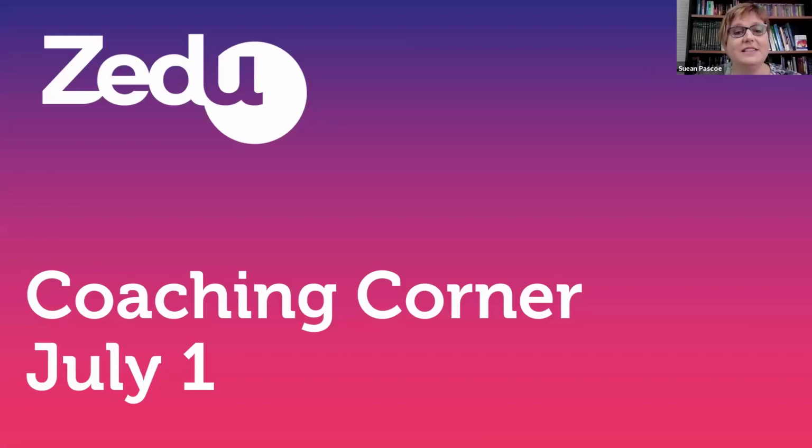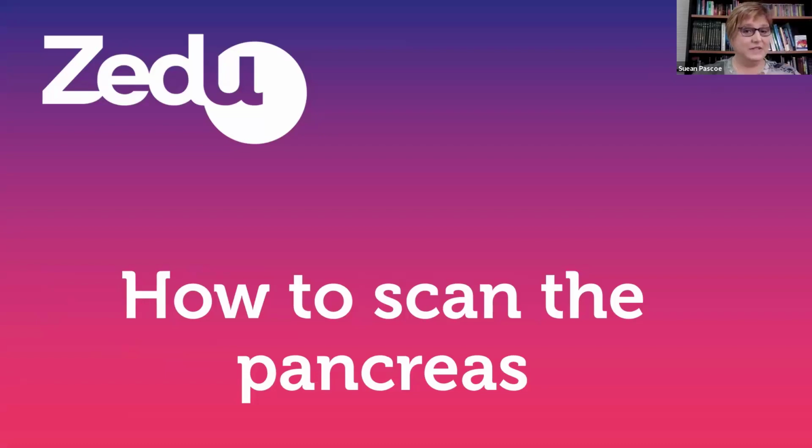Tonight's topic, thanks to Brian and his great suggestion, because I was searching for a topic, tonight's topic is how to scan the pancreas. So we will kick straight into it.